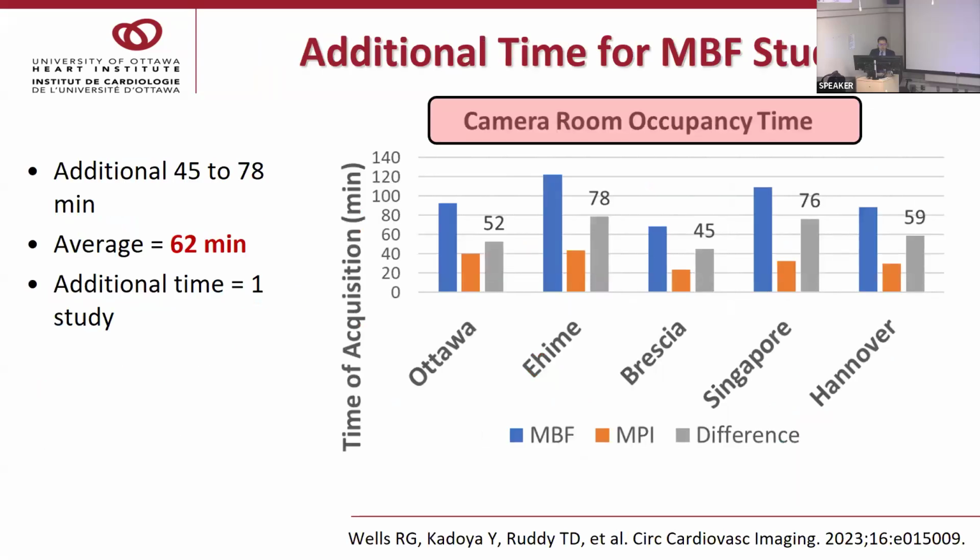But one of the issues with SPECT-based flow measurement would be the additional time to complete the scan. This is data from international multi-center studies showing the extra room occupancy time for measuring MBF in SPECT studies. In our center, we needed 52 minutes of additional time compared to a conventional SPECT scan without flow measurement.